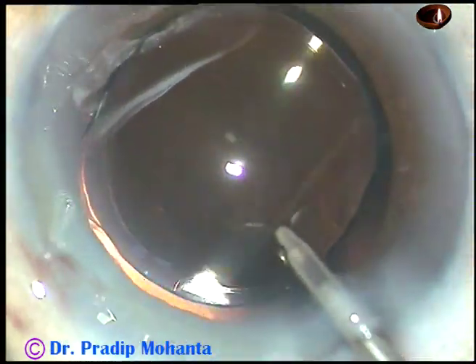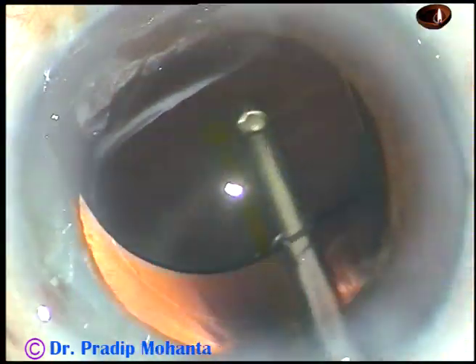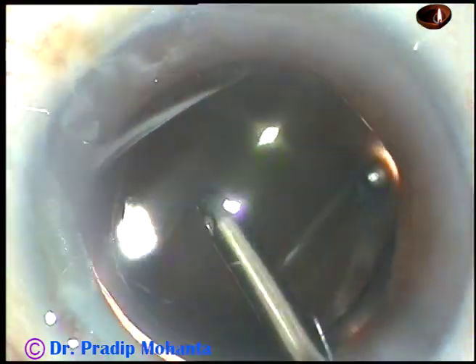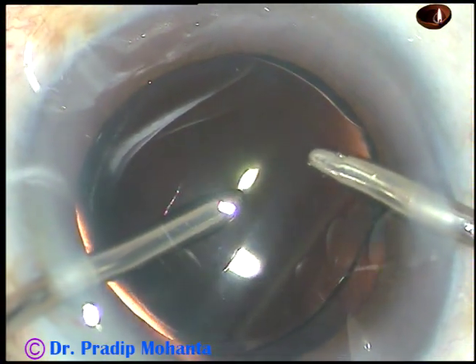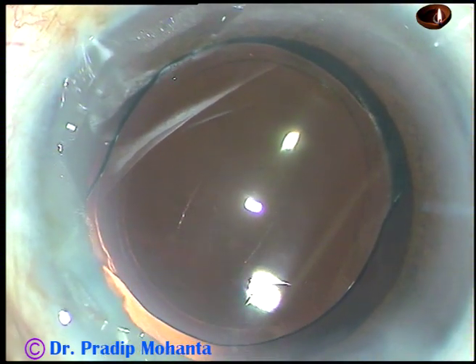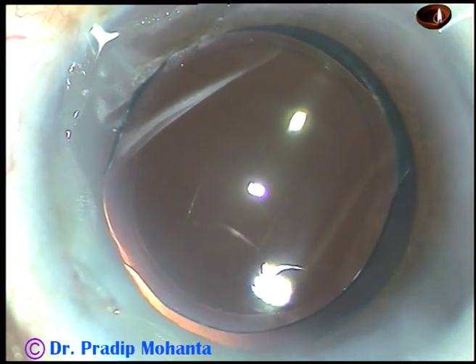And now I use the irrigating probe of bi-manual IA. I irrigate the anterior chamber and the capsular bag for some more time. At this time, when I am irrigating the capsular bag, the fluid wave polishes the posterior capsule. Now irrigation and aspiration are being used together, and I am sure that almost 100% of the viscoelastic substance has been removed.